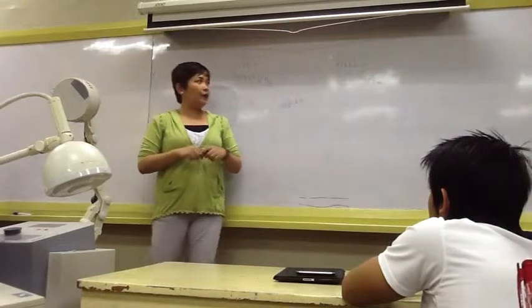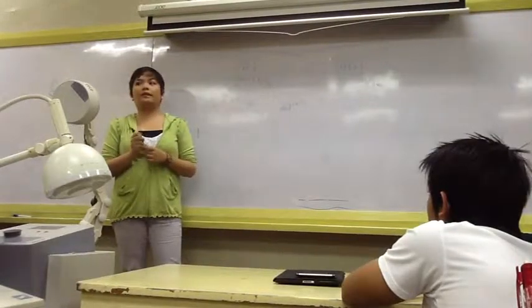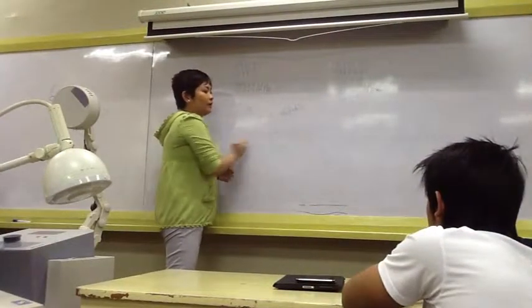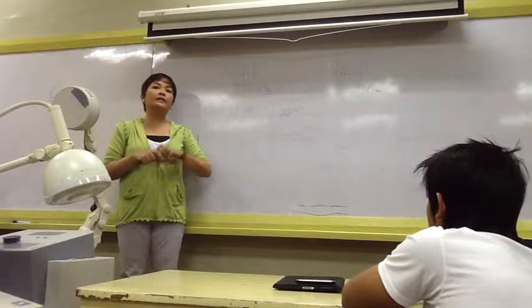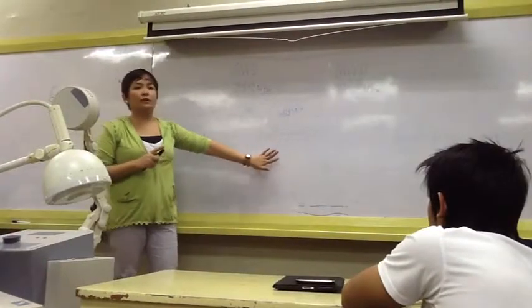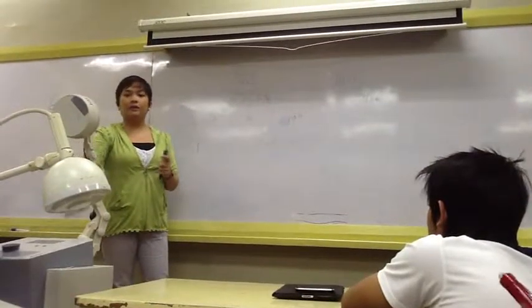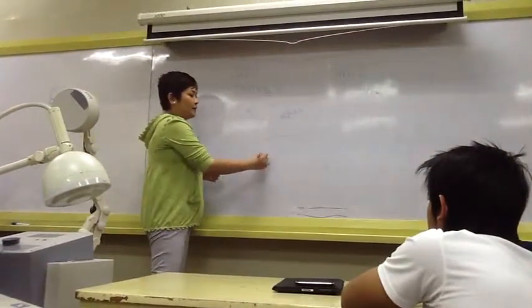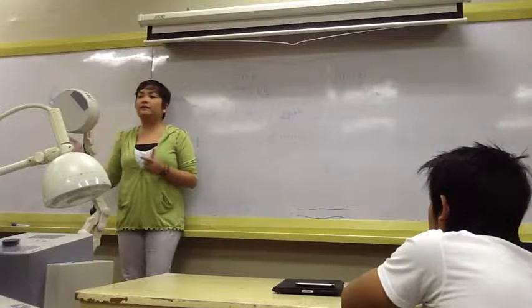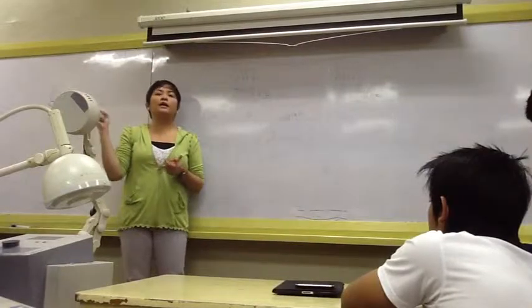For both microwave and shortwave diathermies, we have modes. We have the continuous mode. In continuous mode, normally, ito yung nagbibigay ng thermal effects, whatever thermal effects we know as effects of heating. But for shortwave, particularly for this machine, we have a pulsed mode. Pag pulsed, that means intermittent yung pagbigay ng heat. May time na may heat, and then mag-off yung heat, then magbibigay siya ulit ng heat, and then mag-off. So intermittent siya.